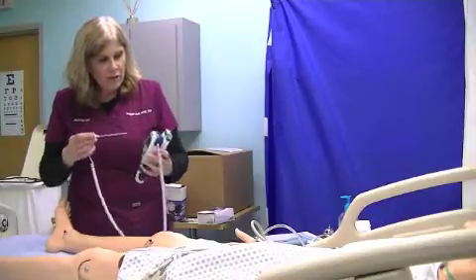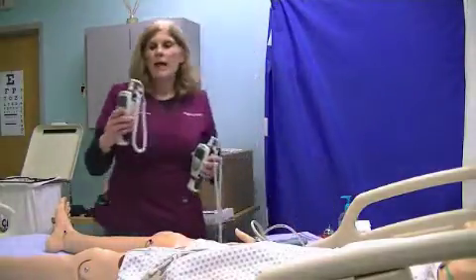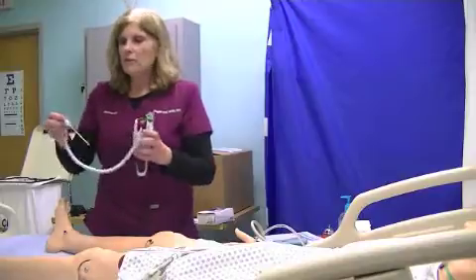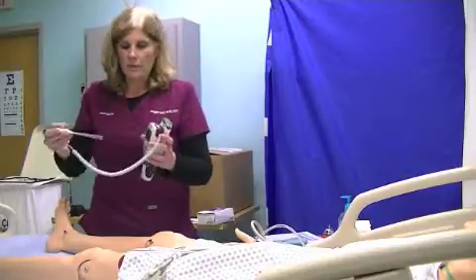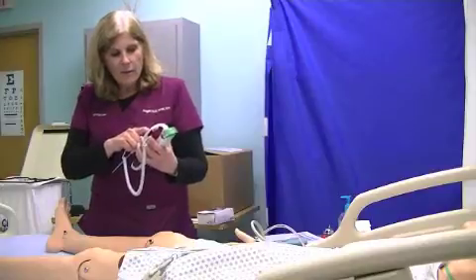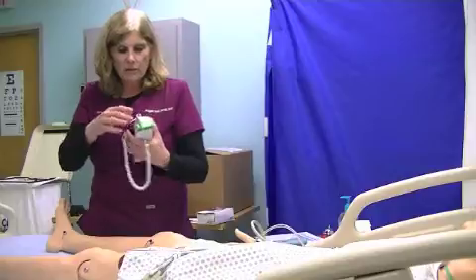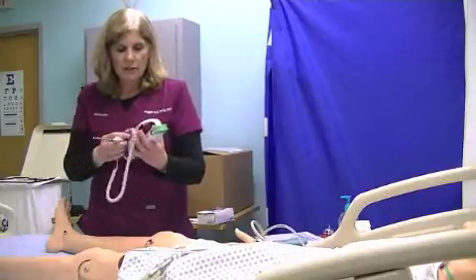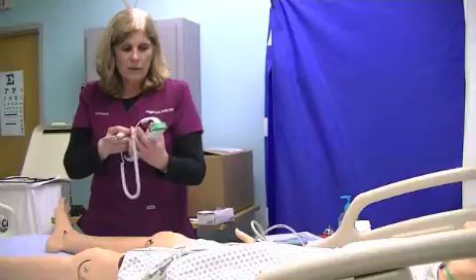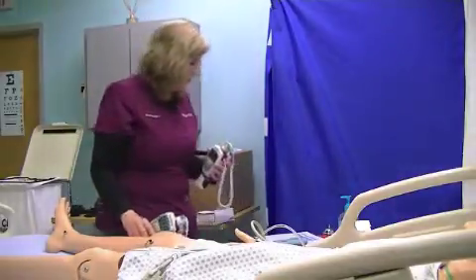And then we have to use the red one, this thermometer that has a red tip on it, and that means we're going to be doing a rectal temperature. So it's the same type of thermometer, but with the red tip and the red probe. It would have the bottom part flashing, and that means for the rectal area. If you push again, you can change it for children to rectal temperature. And that's mostly what we use for children.